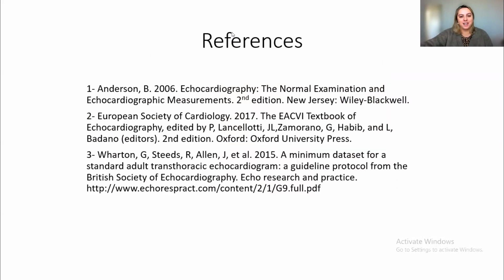Everyone, we do have a couple of knowledge check questions for you to see if you followed the presentation. So give me 1 second. Our first quiz question, you should see a picture on your page and tell us what is the name of this cardiac echo view. There are 4 options for you to choose from. So please take your time to respond, and Dr. Imam then will help us get the correct answer.